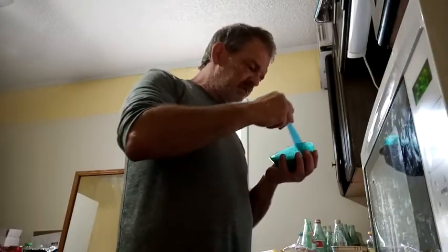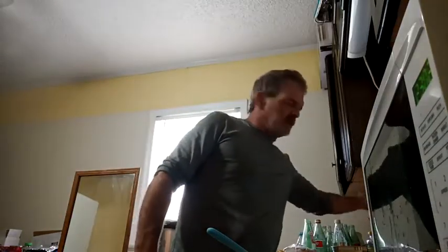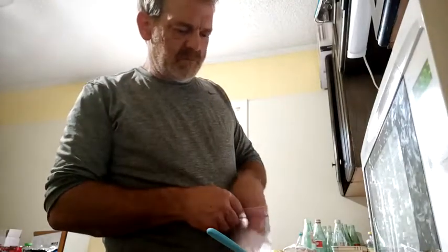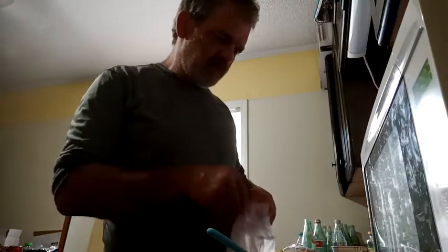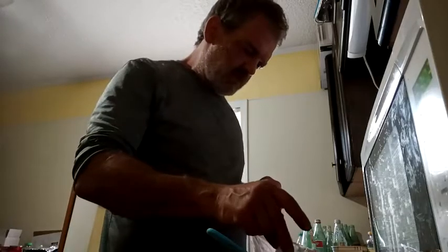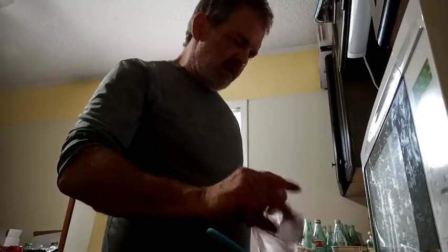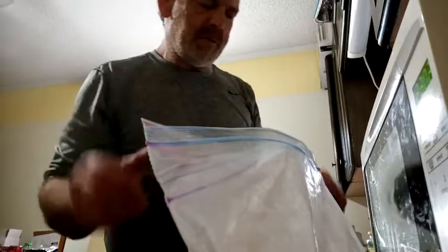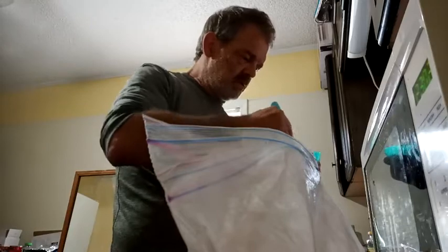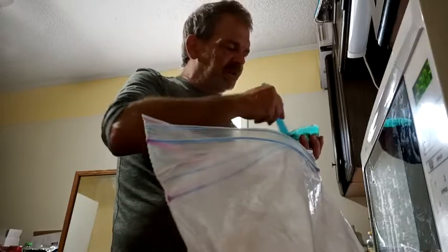See how the stone's looking — still not thick enough to my liking. So I'm going to thicken it just a little bit. If I ever over-thicken it, I'll just add some water to thin it back out. You want it thick enough to the point where it's going to stand up.